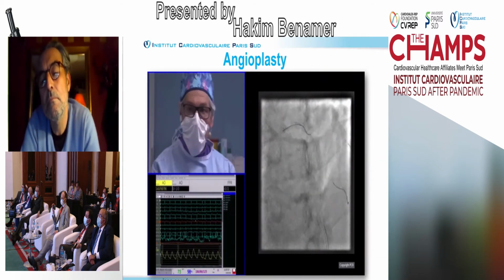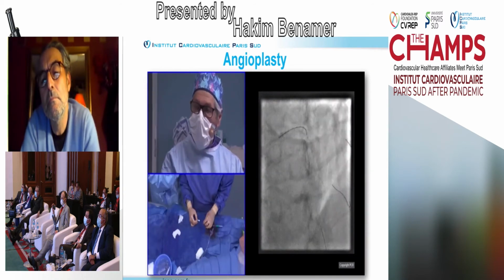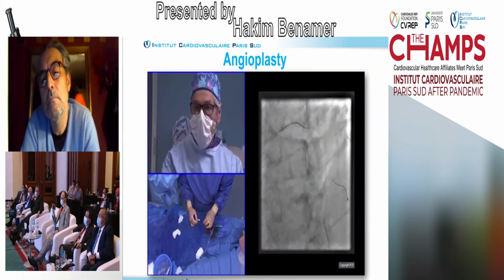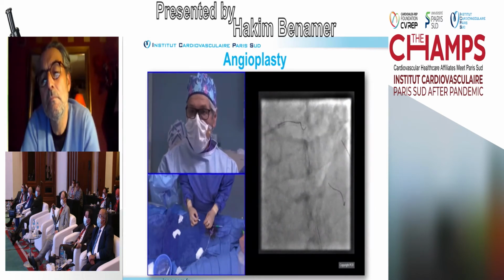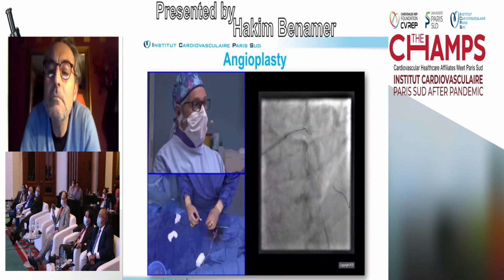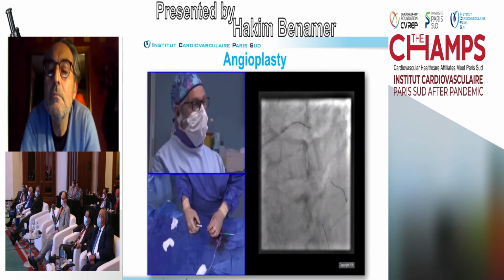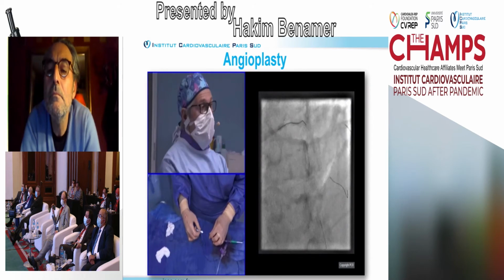We also prefer the struts open because we know there are cases where unopened struts are colonized by neoendothelium, which creates a post-stenosis at the outcome. And we know also that rheology is very important for the long term. Having poor rheology in the side branch may promote atheroma in the side branch or in the main branch.